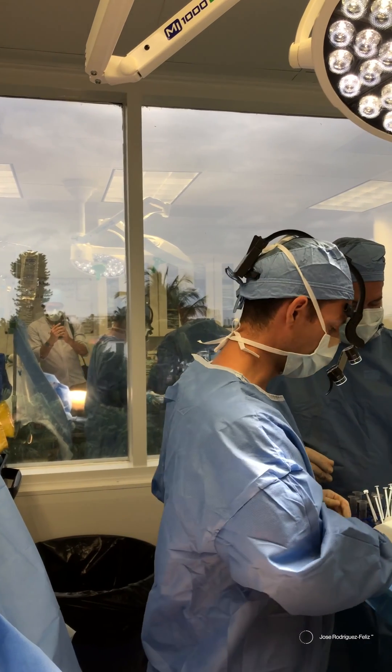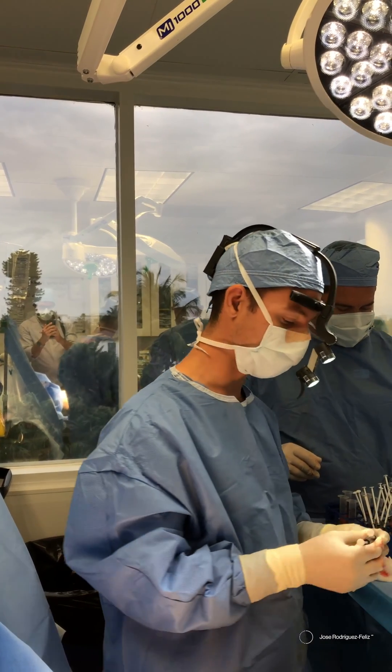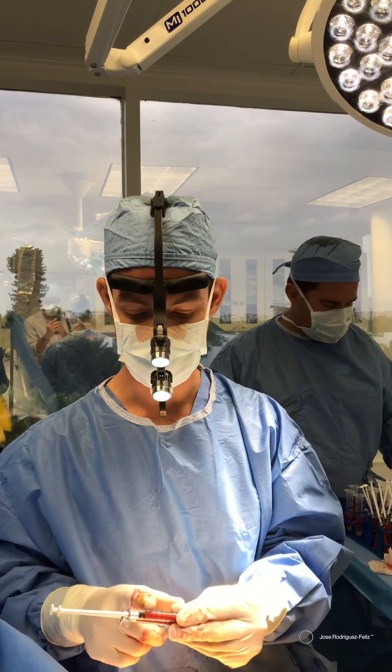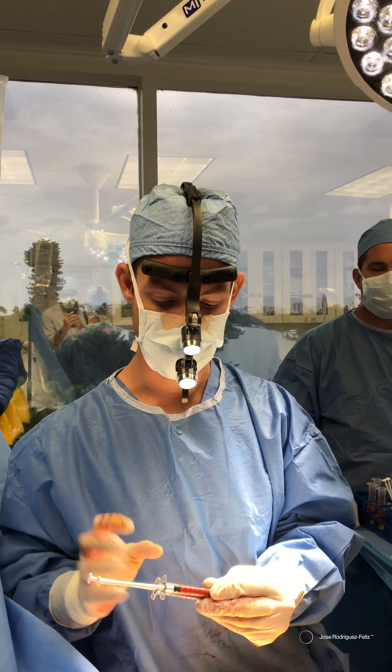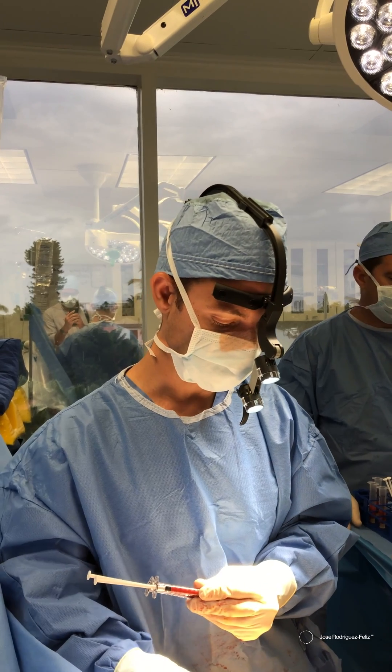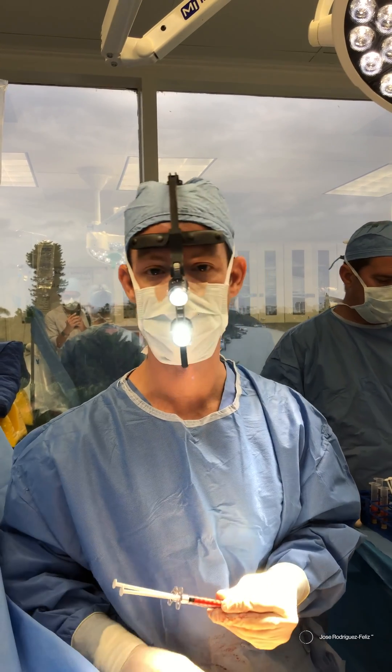We have already done all the processing of the fat, and now we are going to infiltrate it using this one-millimeter cannula. We do very small fat lobules and inject them through small incisions in the area.